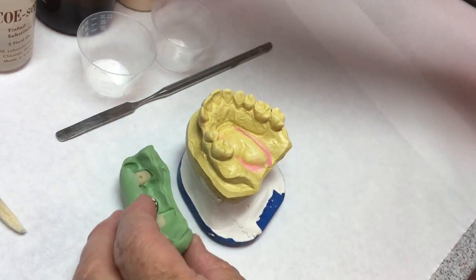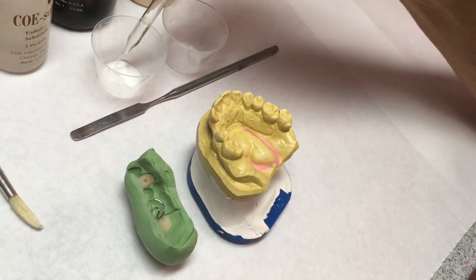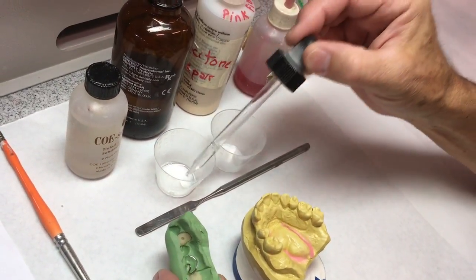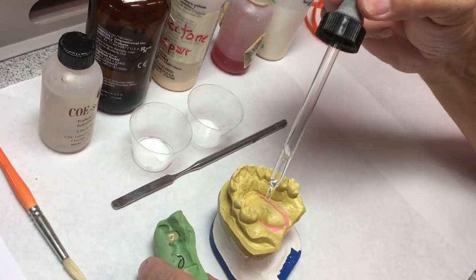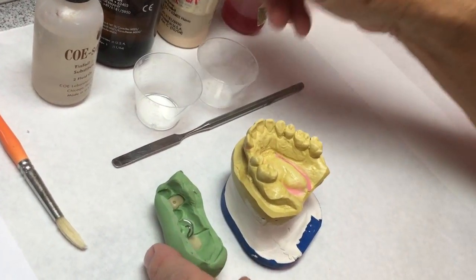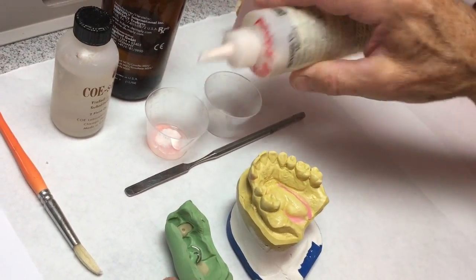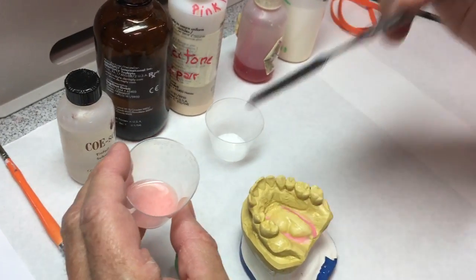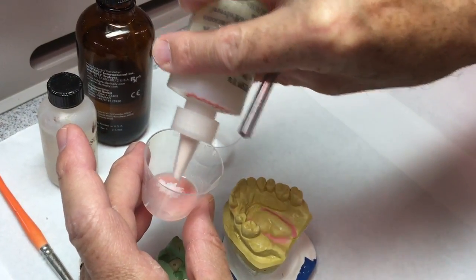The cast has been painted with Cosep. I'm going to start out with pink fibered acrylic that's going to go on the facial so it looks a little more natural, and then I'm going to salt and pepper the palette with clear ortho resin. I'm starting out with some clear monomer and pink fiber polymer and I'm going to mix that up.